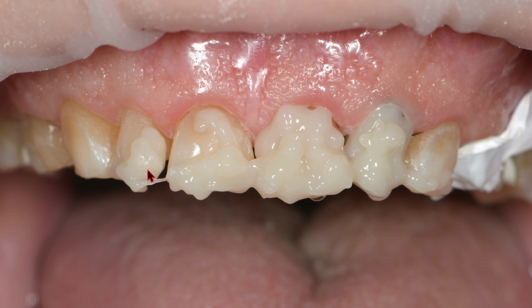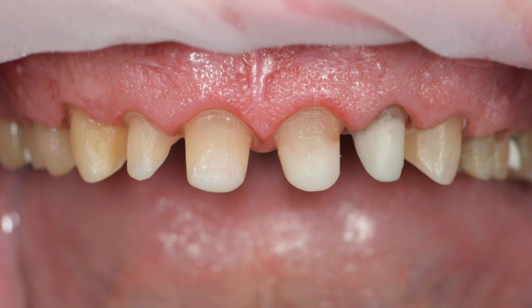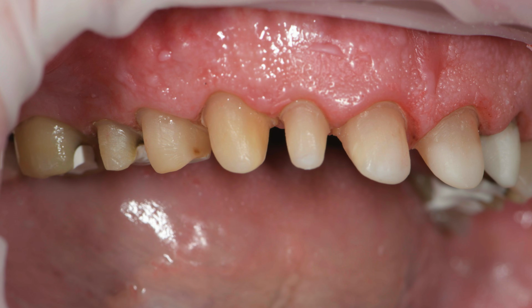In the anterior, I'm using the tooth-colored core paste. In the posterior, I like the white opaque core paste. Here are the crown preps again. Some other views.